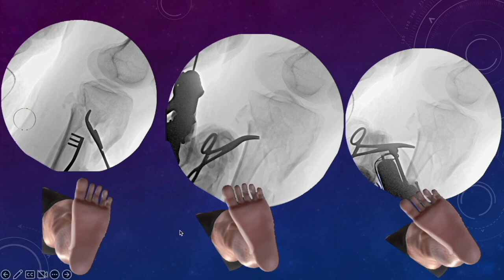So if we try to rotate the tibia internally, the medial condyle will come downwards while the lateral condyle will come upwards. So we'll be able to localize the medial condyle in the posterior part, while the lateral condyle will come in the anterior part. By this technique, you are able to localize the two condyles to some extent. This is the medial condyle while this is the lateral condyle, because the fibula, which should have been lying here, has now come anteriorly, and the lateral condyle has also come anteriorly in your fluoroscopic view.